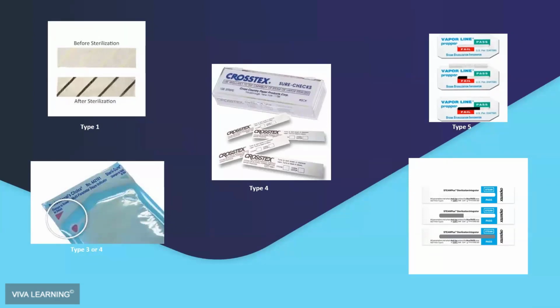So do your research, vet your products before you use them, and they most likely can be heat sterilized. A lot of times we make the assumption that they can't be, but spraying them with a disinfectant is not appropriate. They must be immersed in a high-level disinfectant if they have been used in the mouth.